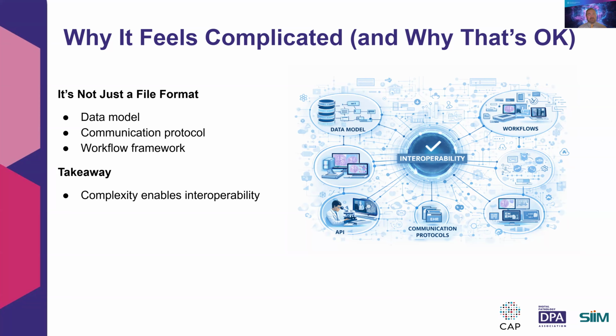So if you only remember a few things from our presentation, just remember that DICOM is the standard that allows medical images to be shared and understood across systems. It acts like a universal container for both images and their meaning. And in pathology, it's the key enabler for scalable digital workflows and AI adoption. So even if the details feel dense, the goal is simple. We're looking to make pathology images as interoperable and portable as radiology images are today.